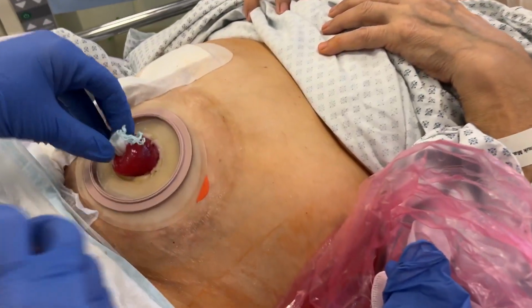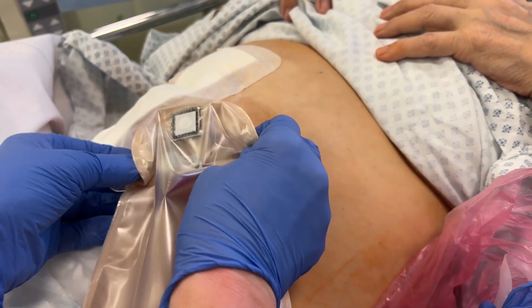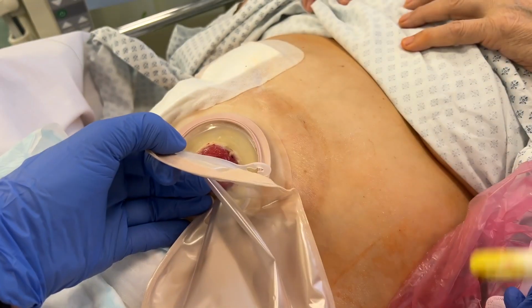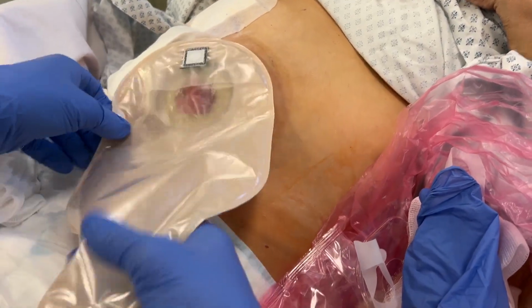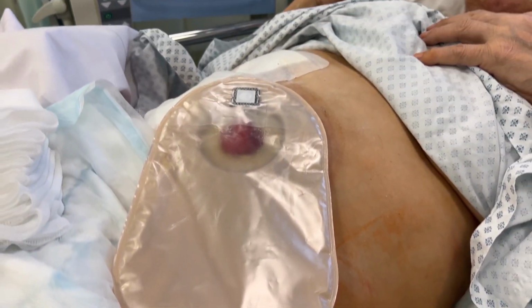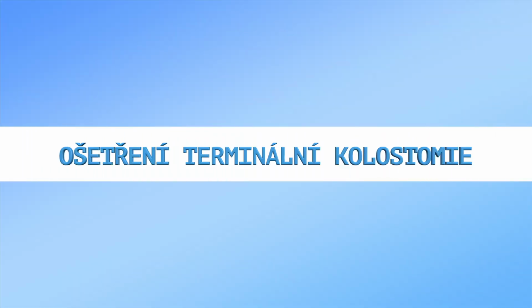We snap the pouch onto the base plate with a guiding ring, and if a tampon is in place, we carefully remove it. We check that the pouch is securely attached and that the outlet is closed. Drainable pouches may have a Velcro closure at the bottom, allowing waste to be emptied without removing the pouch.